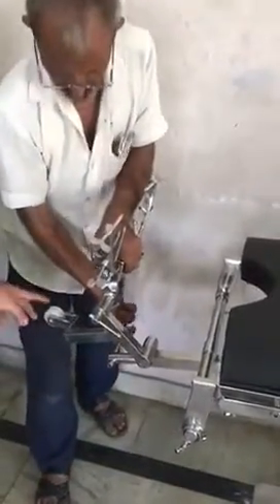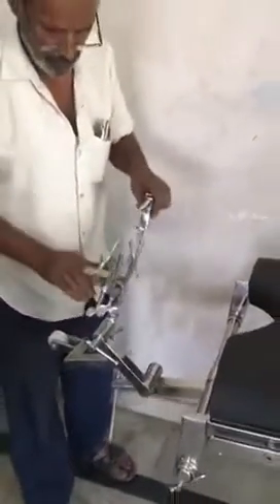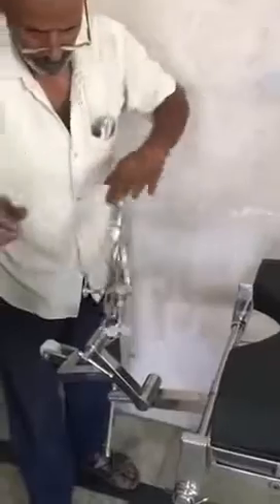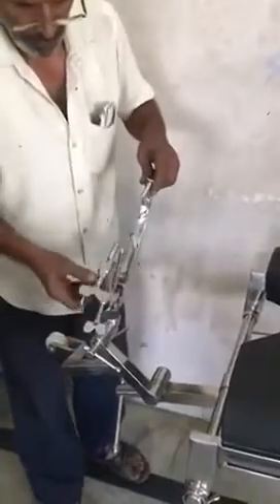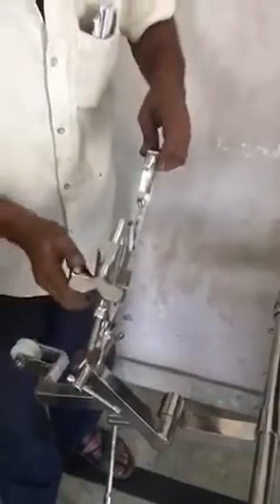Right here we also got the neck traction for the facility of the surgeon while doing the surgery. For easy access, this can be moved very easily as you can see in the video.